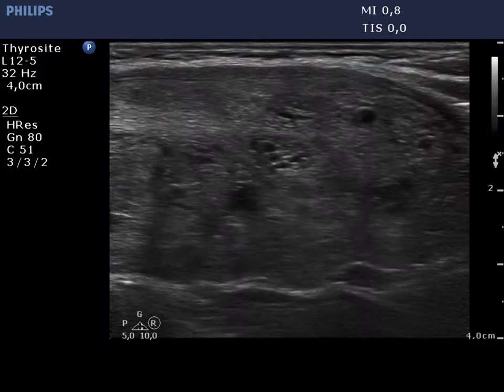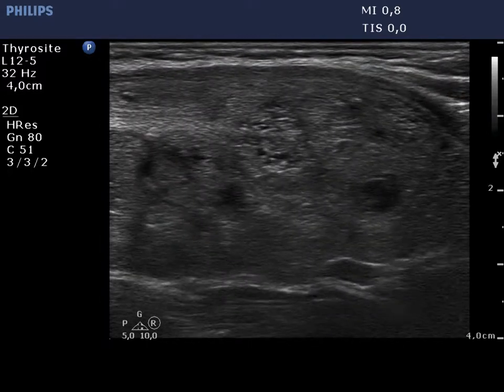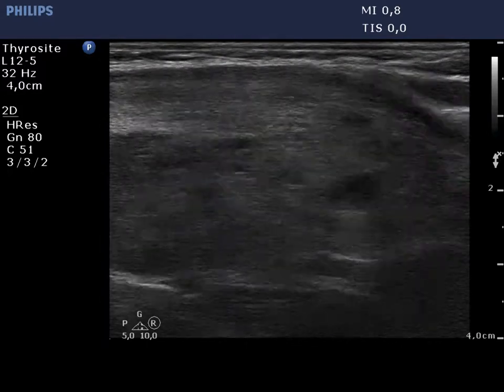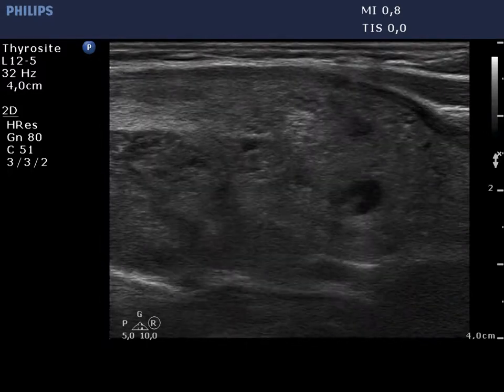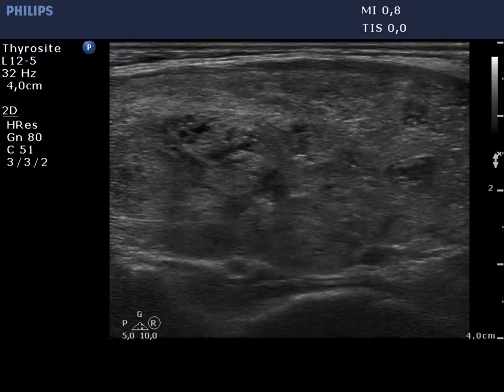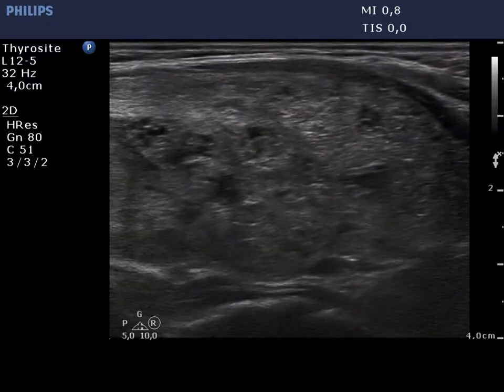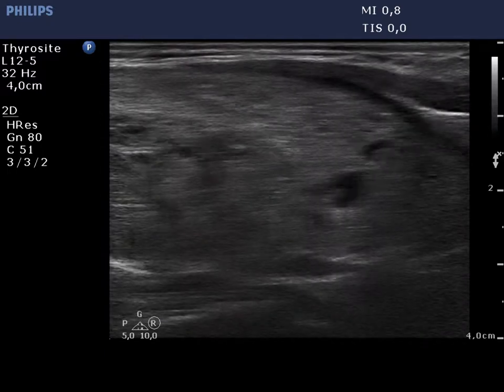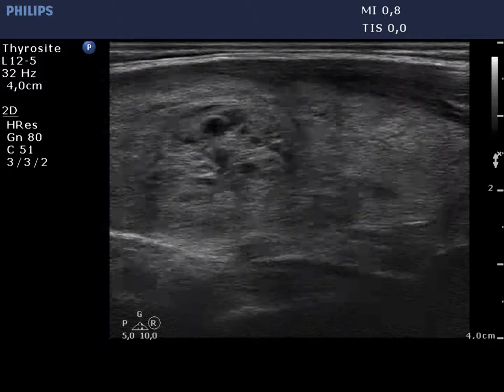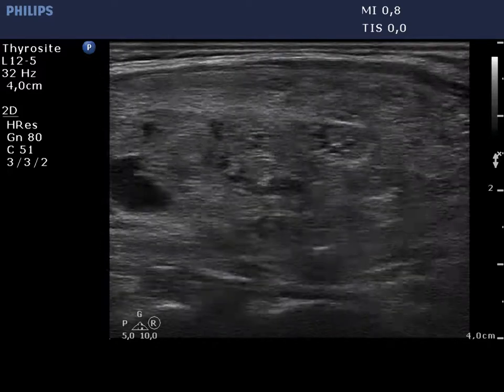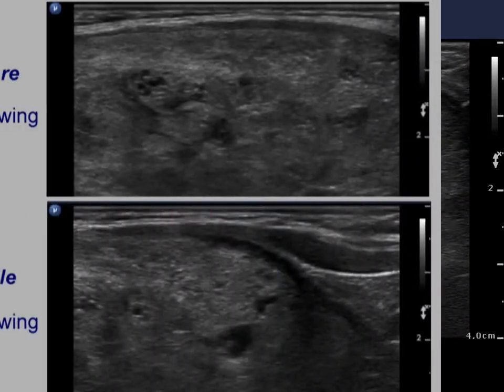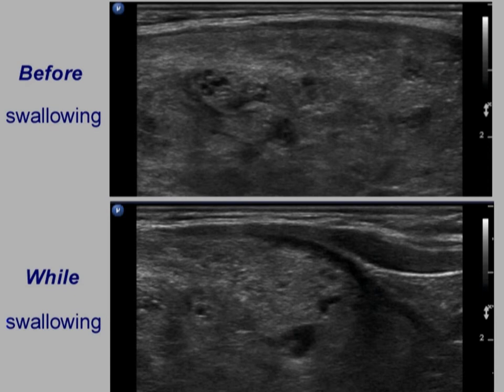Now the longitudinal view is presented. Note the lower pole of the lobe, on the right in the video, before swallowing. The upper image demonstrates the position before, while the lower one shows the movement while swallowing and when the lower pole came into sight.